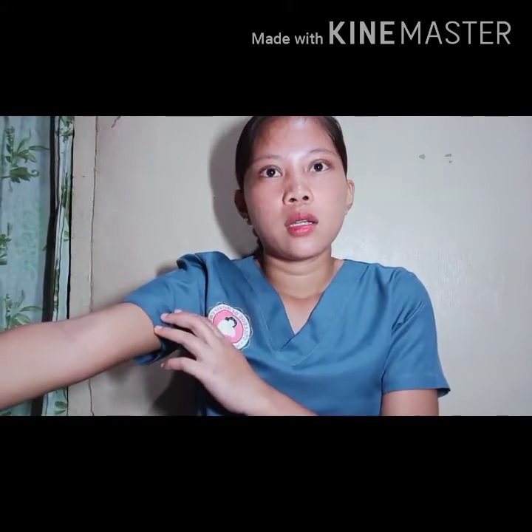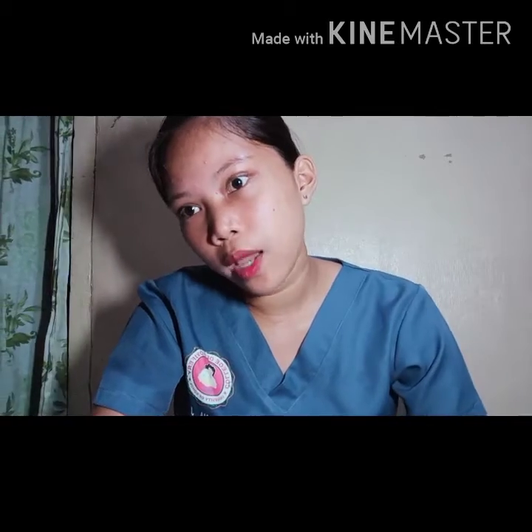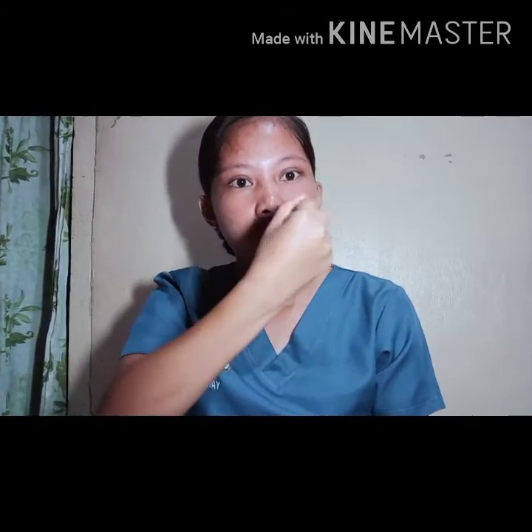So next thing to help dilate the vein is gravity. Position the extremity lower than the heart. So the patient's hand should be positioned lower than the heart, so that gravity helps. Another helpful thing is fist clenching. You instruct the patient to open and close his or her fist. That makes the vein clearer. Have the patient clench their fist.